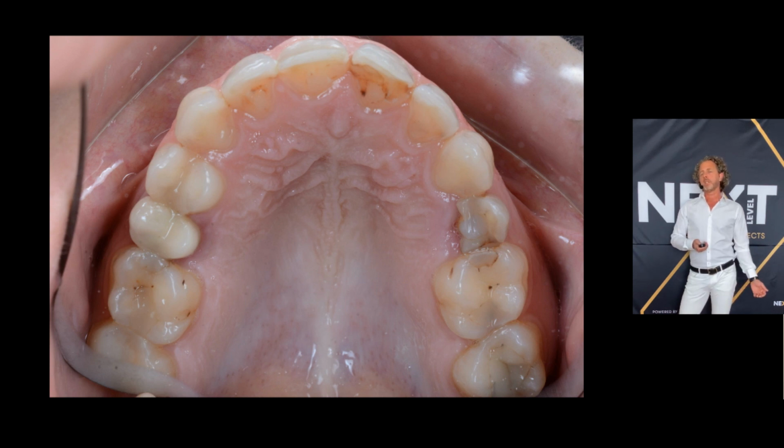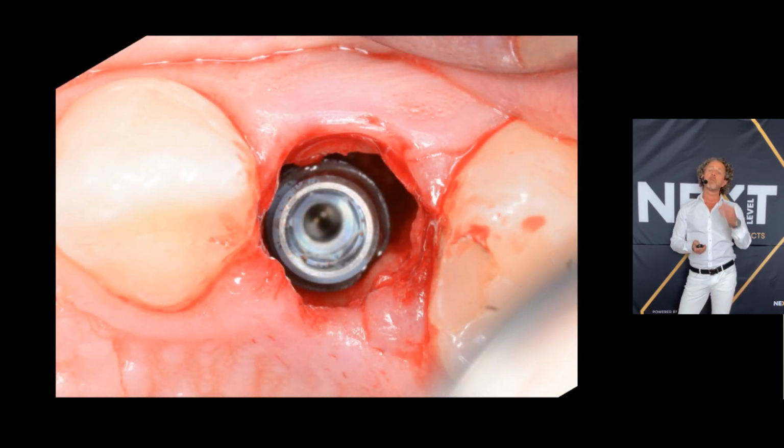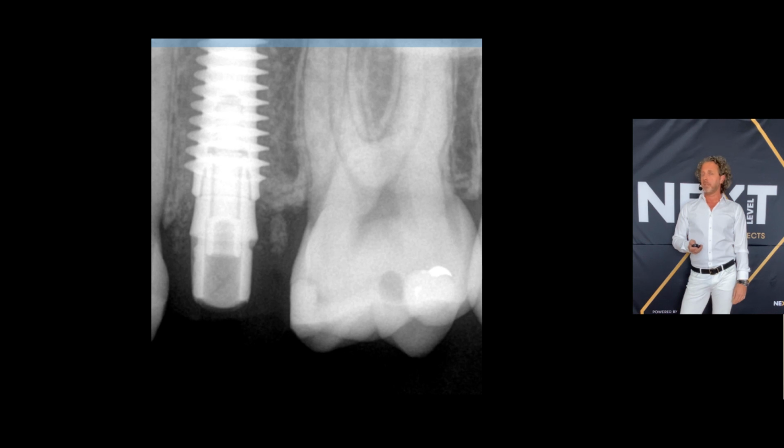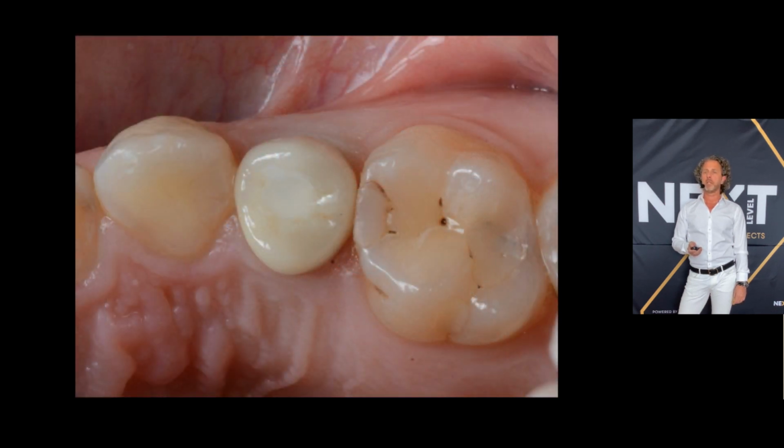So, socket shield is not only for anterior dentition. This case shows us a fractured upper premolar. So I remove the palatal fragment, shape the shield, place an implant, make it immediate temporary, and look at how the tissue looks after 6 months with the temporary. No tissue collapse at all.